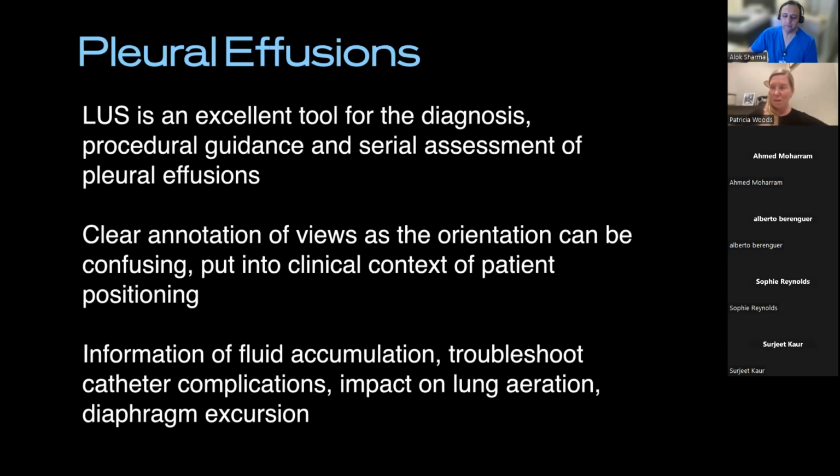I think, like I say, the very sick babies, we do tend to have nursed prone. And if that's how I'm finding them, that's probably more relevant to the baby than to me. What's the impact of it for the 8 hours they're in that position? I think it's more about access to the chest wall, being really gentle, being really mindful of skin integrity and pressure. And in ultrasound, you don't get better images the harder you press. I think I've seen that before with our team, and get indentations and stuff. So I think put it back into the baby. How is this baby nursed most of the time?